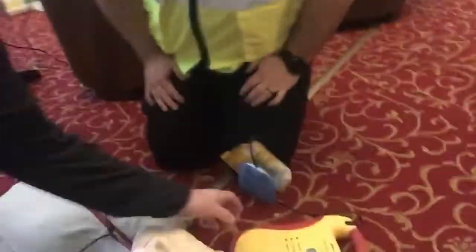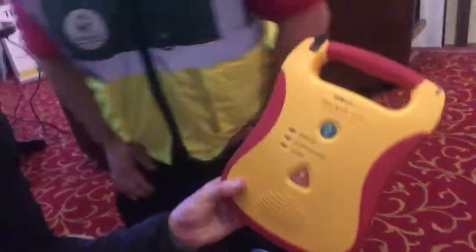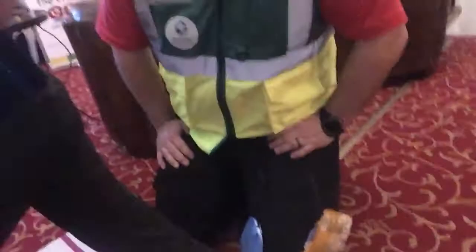Hello there folks. Tonight is the first night of the Community Response First Responders group, and a gentleman is going to show us how this machine works. What's the name of this machine? It's an AED. So is this usually found everywhere, in every shop or around town?